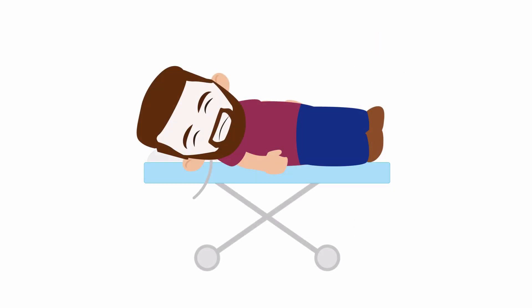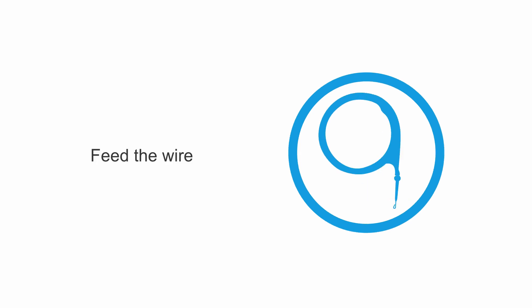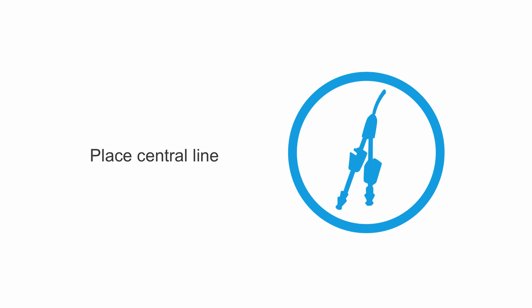If the patient is really sick and needs multiple medications and is going to end up in the intensive care unit, don't do the EZIJ — just place a triple lumen catheter. But the good news is, if a patient already has an EZIJ and suddenly gets worse and needs a triple lumen, you can use the EZIJ site to place a wire. Disconnect the IV and sterilize the site, and because you used an 18-gauge IV, you can feed a central line wire directly through the IV into the internal jugular vein and place the central line using the traditional method.